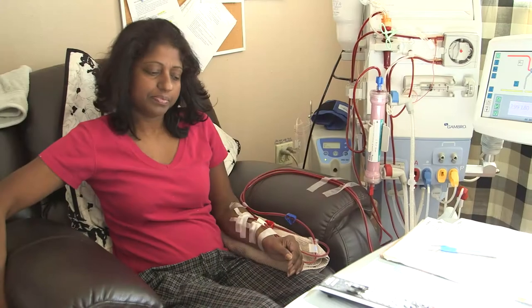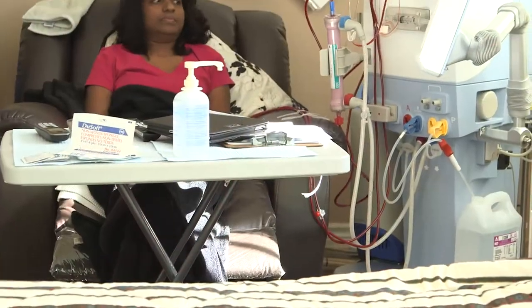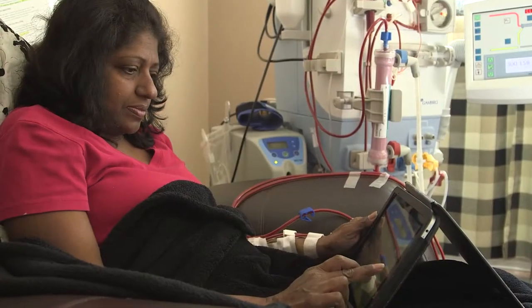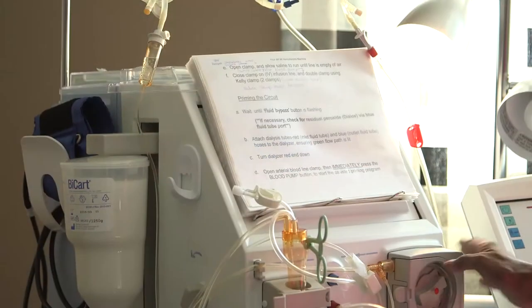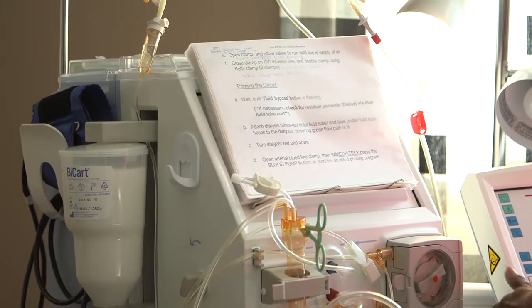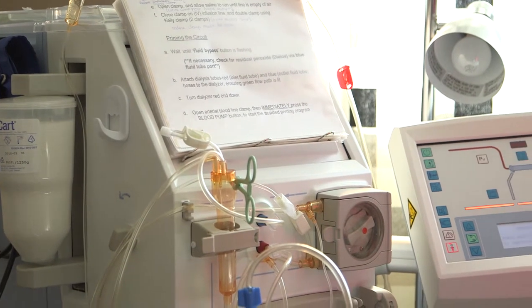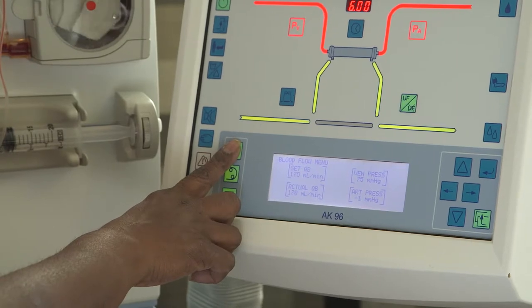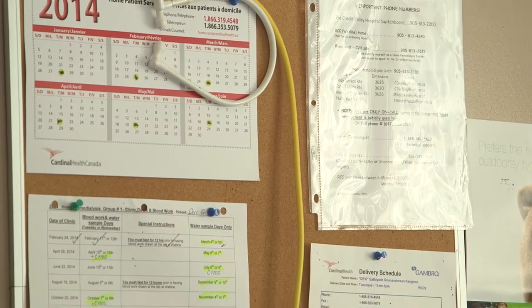Blood pressure is recorded again and the patient settles in for the exchange, during which many patients sleep or rest, enjoy a book, watch TV, or stay in contact with friends and family online. Patients can expect full training for home hemodialysis lasting anywhere from three to eight weeks, covering machine operation, proper needling for vascular access, ordering supplies, and more.